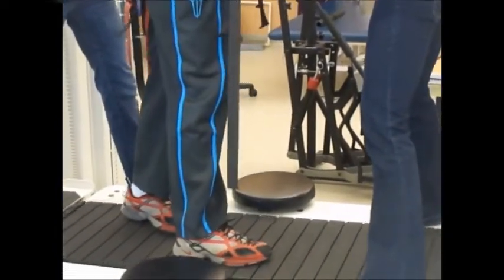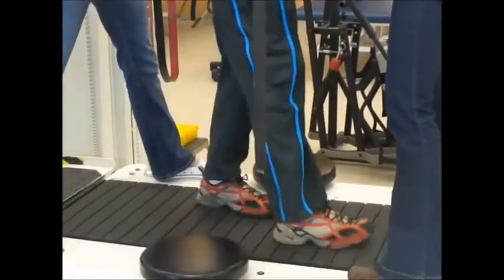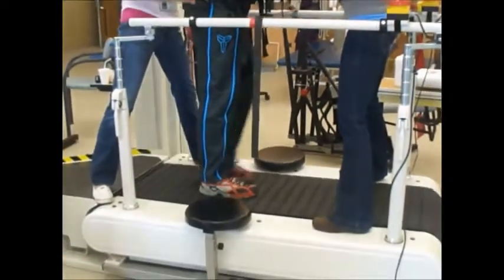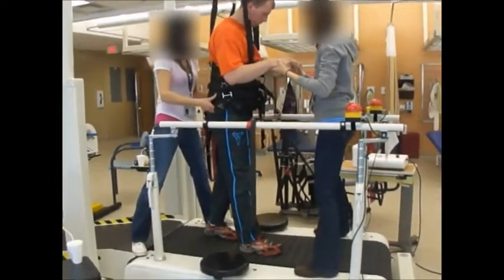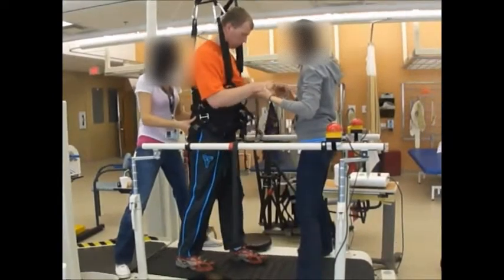This machine was really nice — it's like a harness on top of you that you can wear, and you can adjust the weight. My full weight, I think it's around 90, that's on there right now.